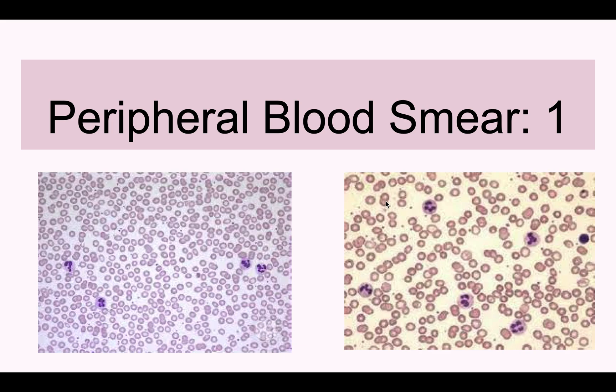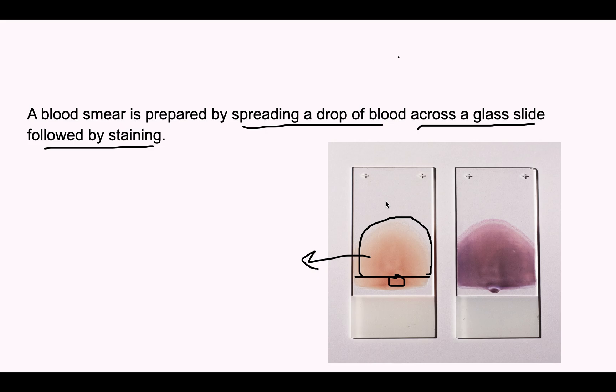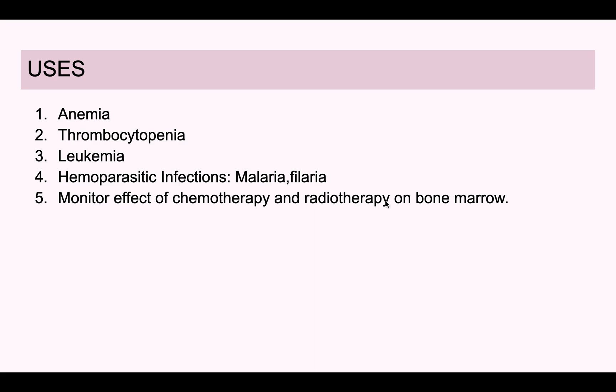We will discuss peripheral blood smear — how to prepare the smear and how to stain it. A blood smear is prepared by spreading a drop of blood across a glass slide, followed by staining. Here we can see a drop of blood is taken, smeared and spread along the slide. This is the unstained one, and after staining, this is the stained blood smear.